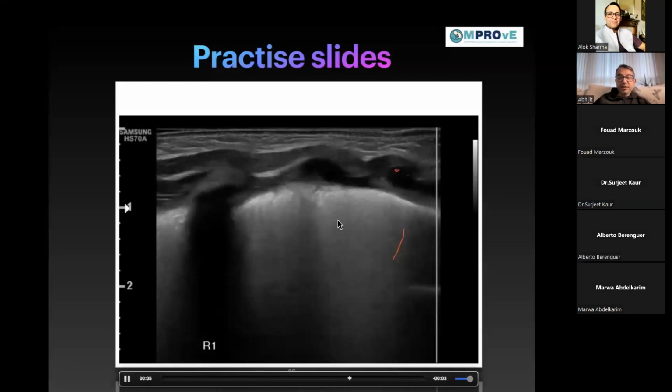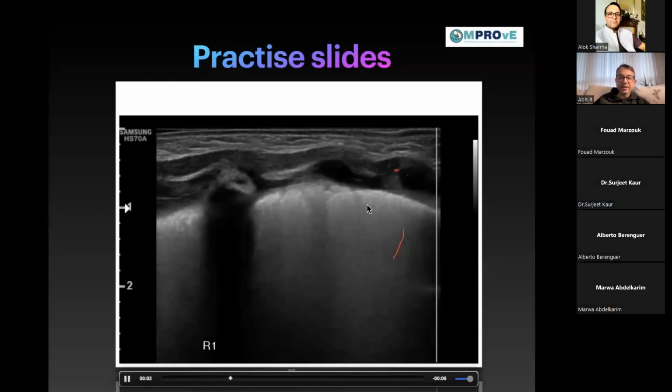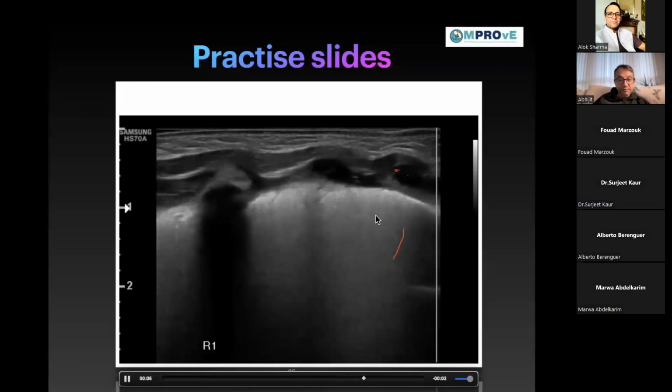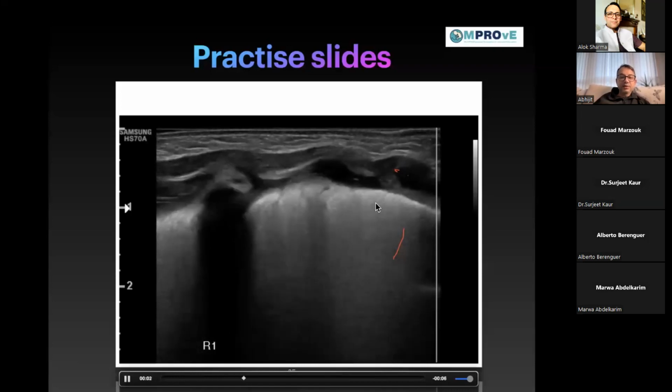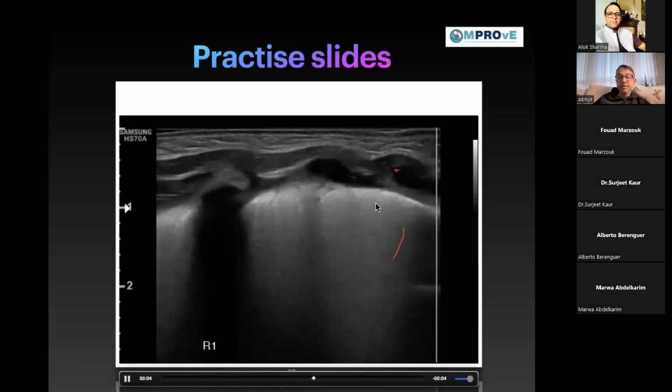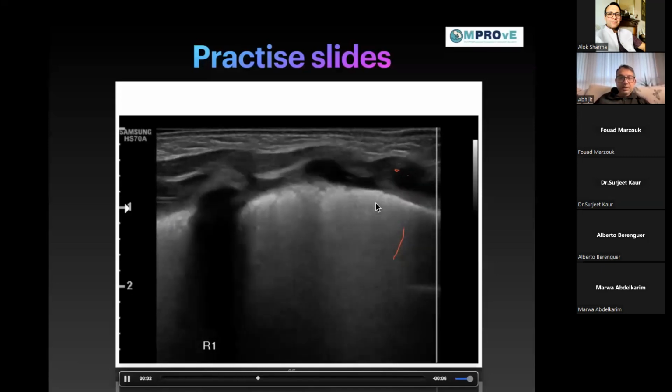People might say, oh, the baby is on 25% or 29.9%, it hasn't hit the 30% magical number. But don't worry, that will be RDS because the signs in the lung ultrasound precede the FiO2 requirement in babies. So this baby is not requiring oxygen now, but later on, who knows, after 72 hours, might be heading for an intubation. Right.